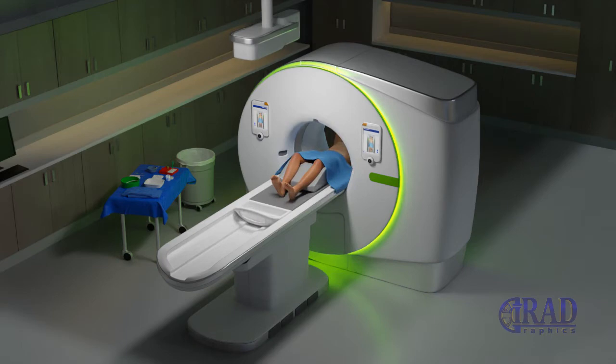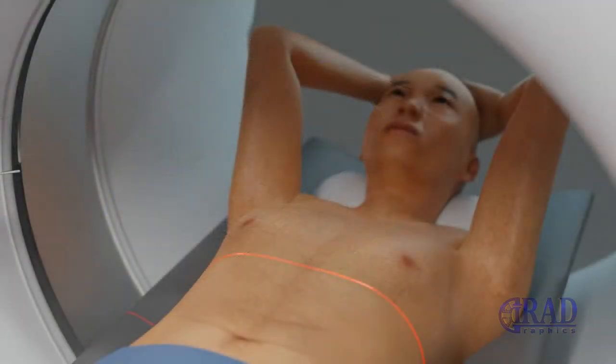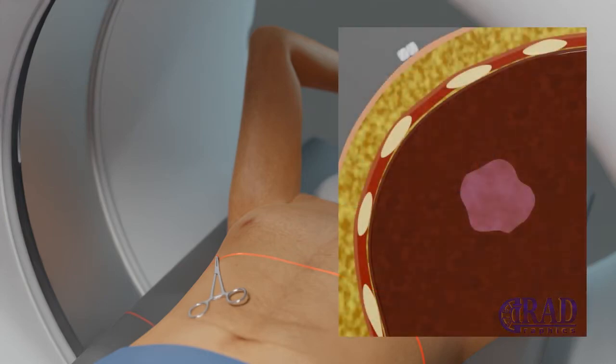The patient lies on the procedure table. The initial CT scan is done. The location of the lesion is determined and the entry site is marked on the skin.